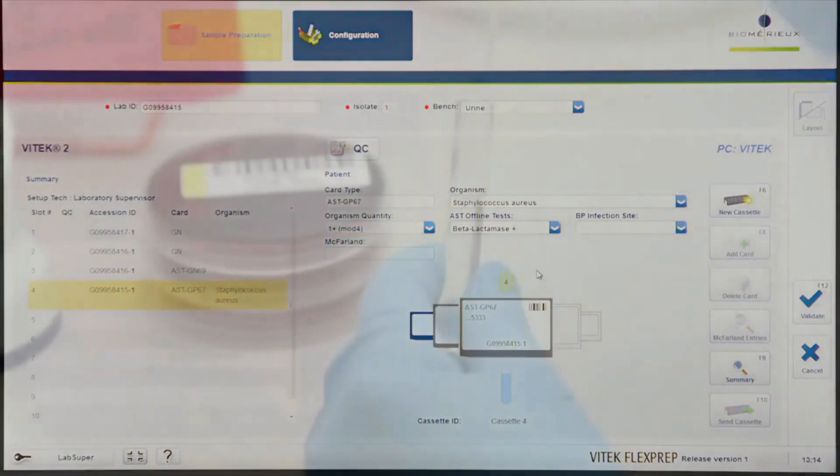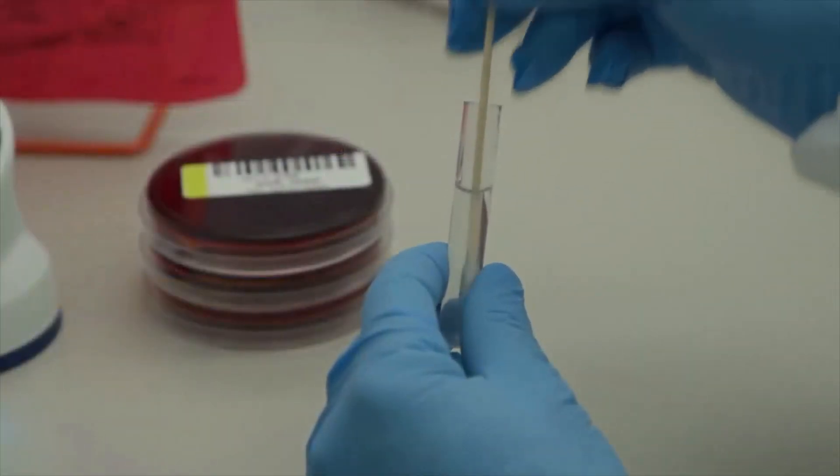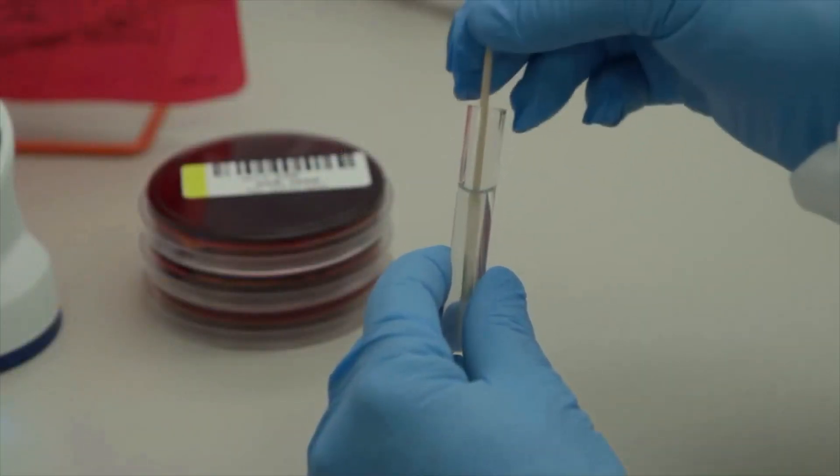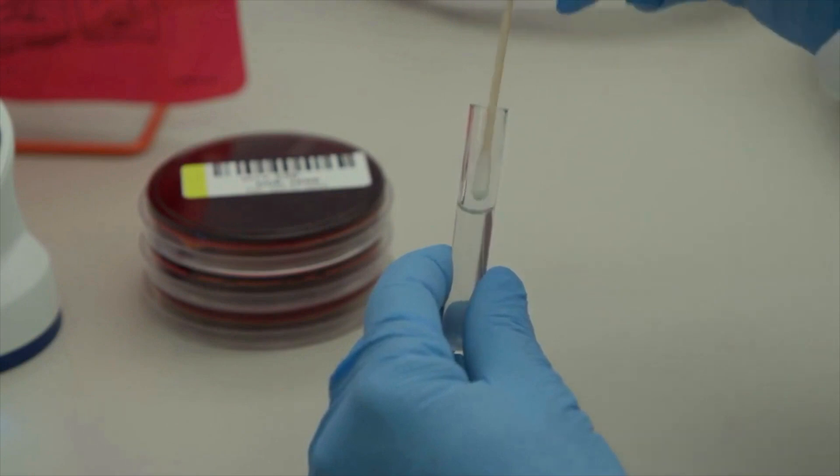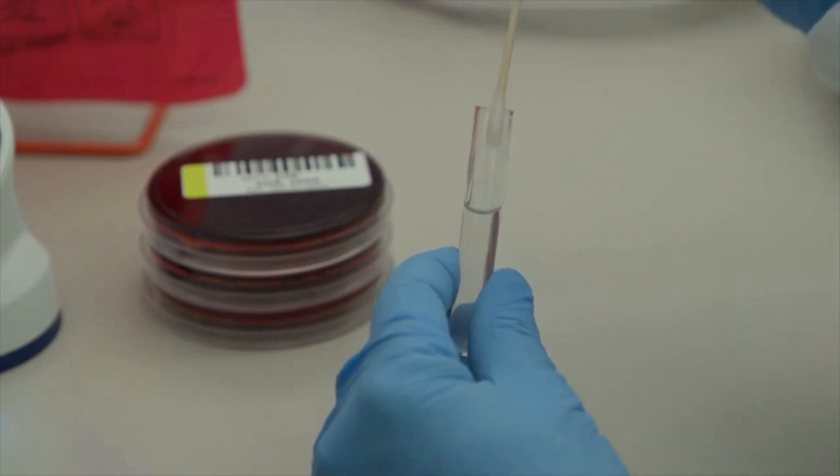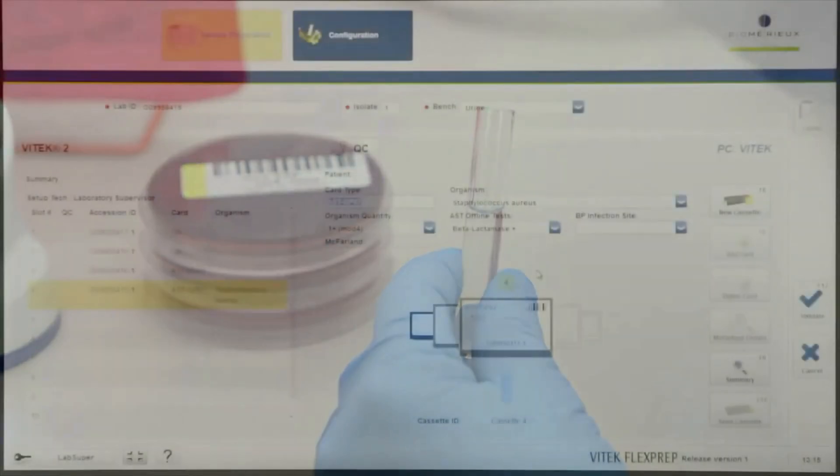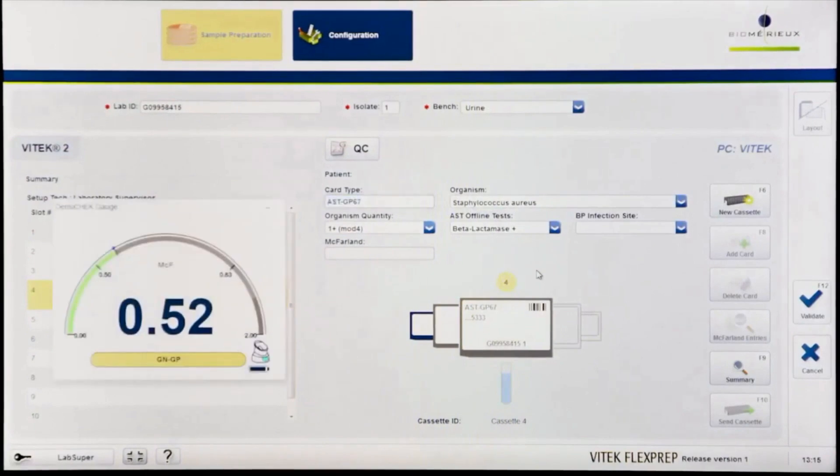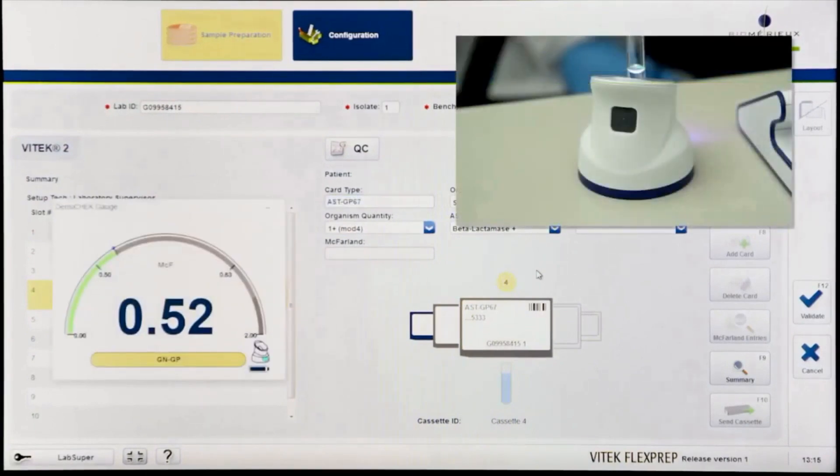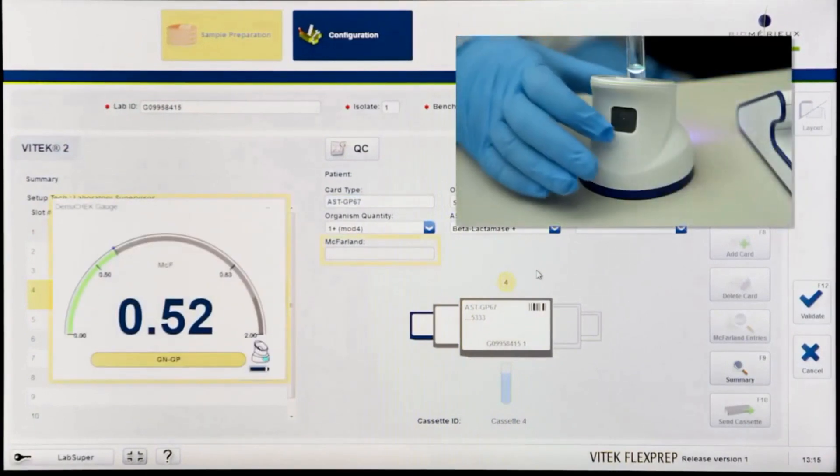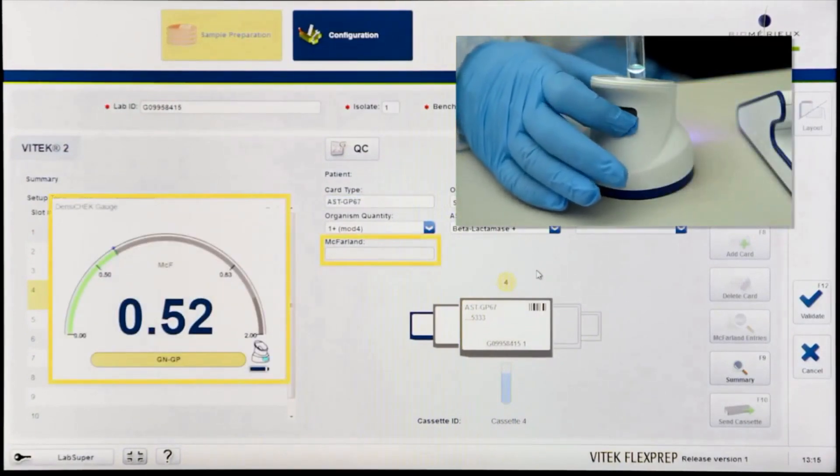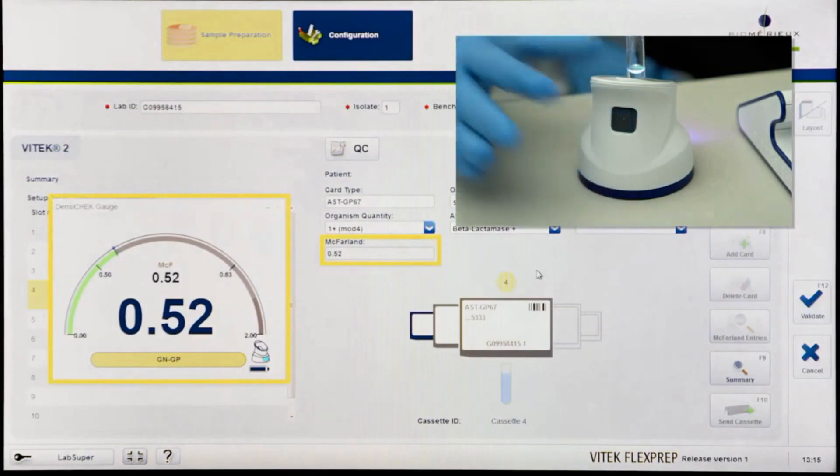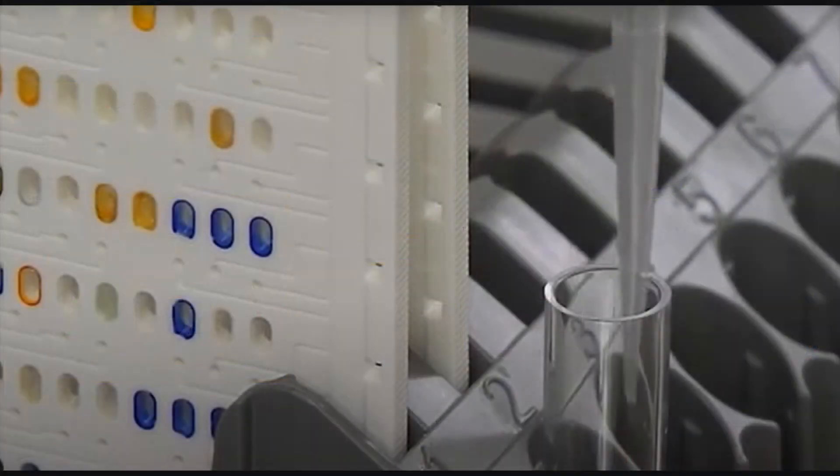Prepare the organism using well-isolated colonies of an appropriate age from an appropriate media. The Vitek Densa check will indicate if the suspension is of the correct turbidity or requires adjustment. Press the button on the back of the pod to transfer the accepted McFarland value onto Vitek FlexPrep. Make the associated AST dilutions.